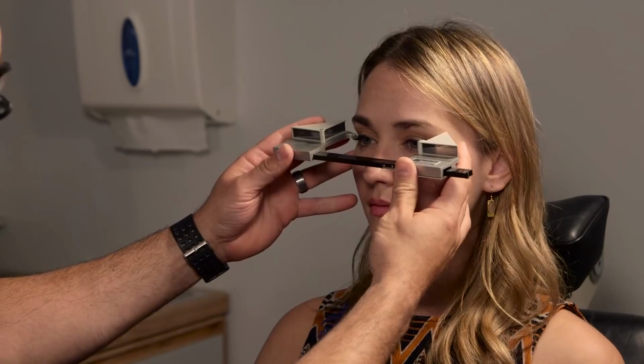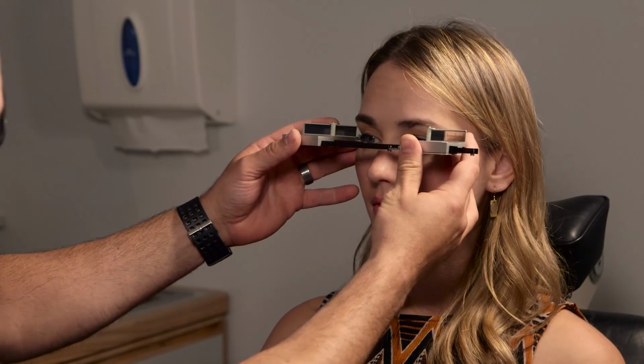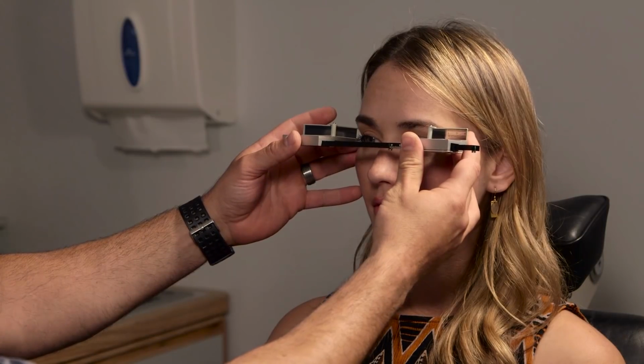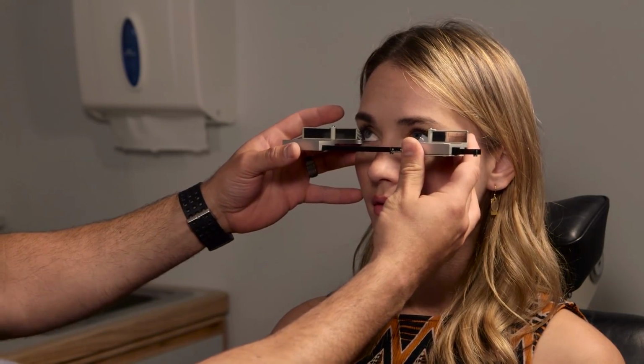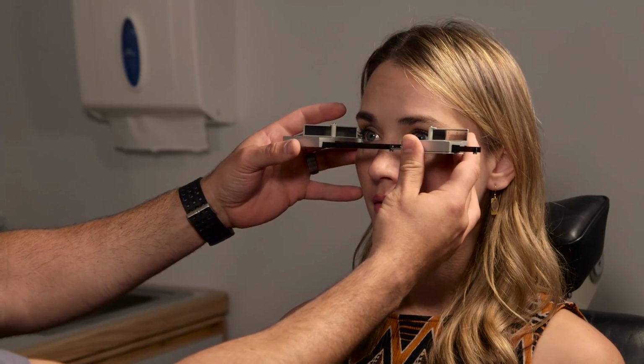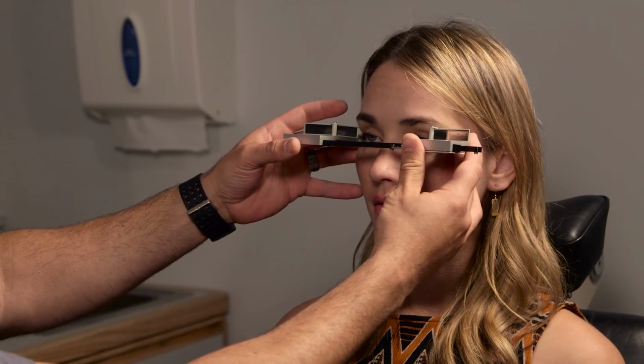I'll be as gentle as I can. Perfect. So you can see I'm right at those lateral canthal angles. I'm parallel to the floor. Okay, and then open up really wide for me. And then what I'm doing is lining up the two red lines that you see in there. You want to move your head into those two lines that are sitting on top of each other.